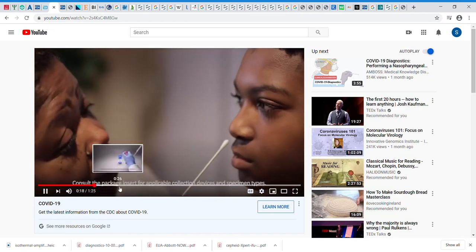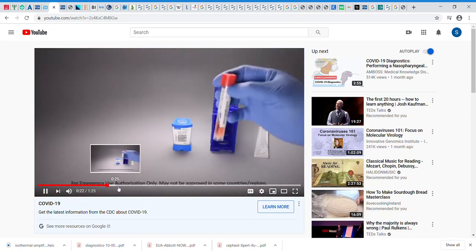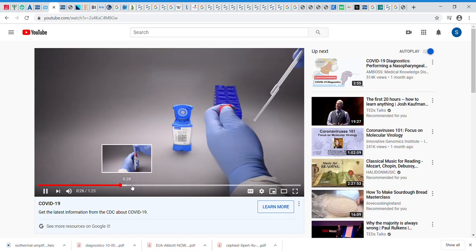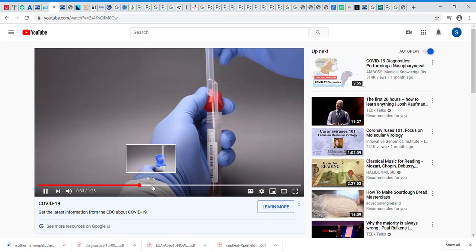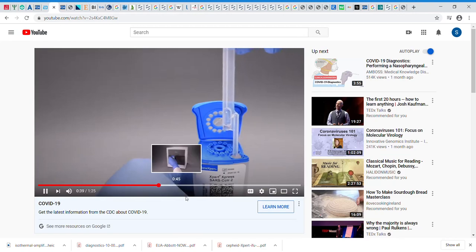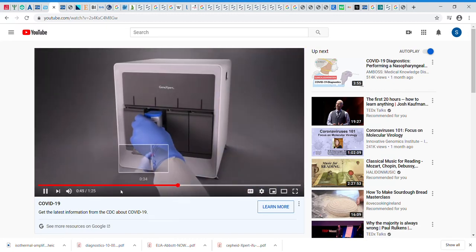So here you see, it begins with a clinician collecting a patient sample. The patient sample is mixed in a tube. They actually say specifically shake it up 5 times. Using the included pipette, this is then transferred into the Cepheid cartridge, which already includes the testing reagents. The lid is snapped closed, and the cartridge is ready to place into the GeneXpert system.